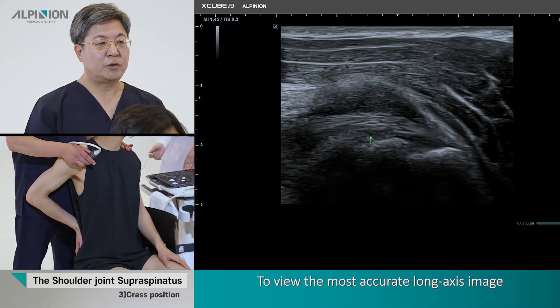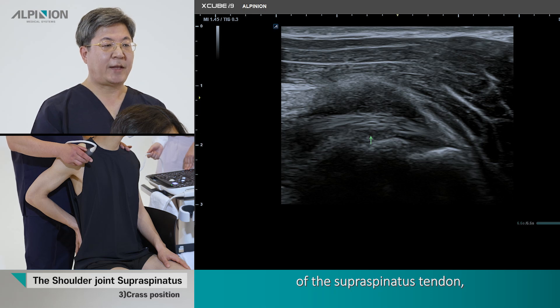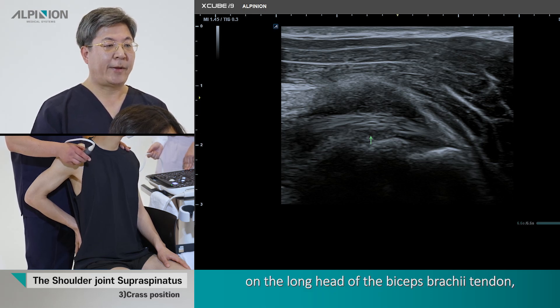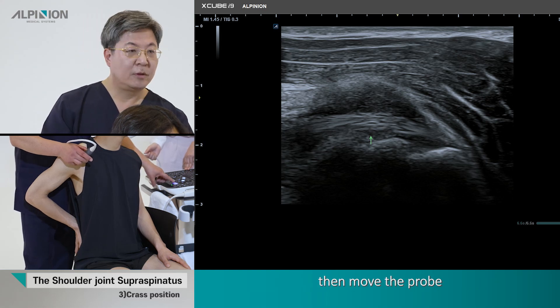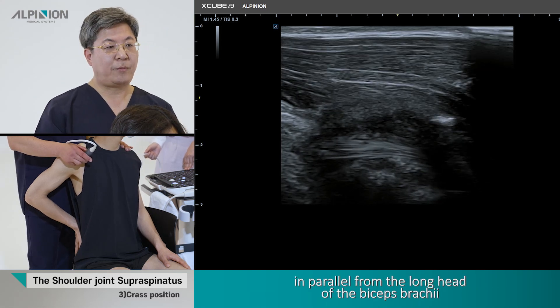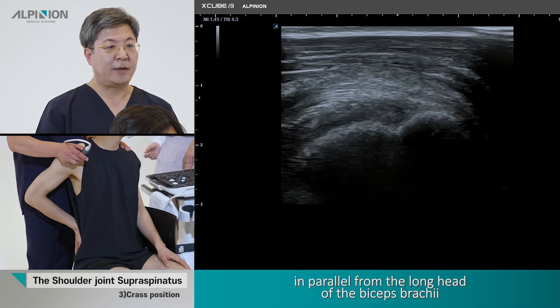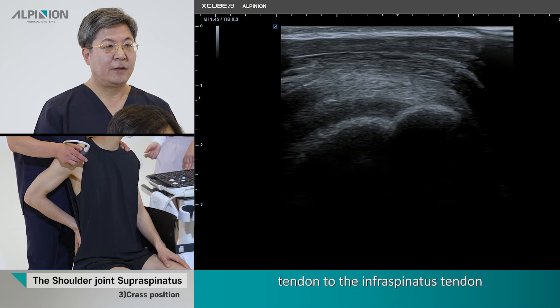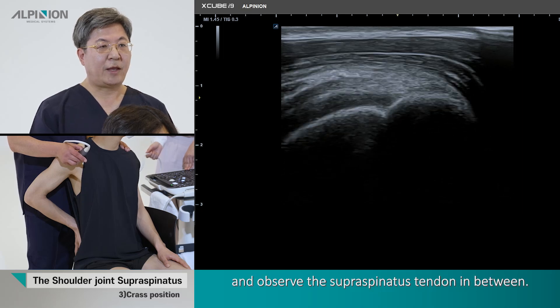To view the most accurate long axis image of the supraspinous tendon, place the probe along the long axis on the long head of the biceps brachii tendon. Then move the probe in parallel from the long axis of the biceps brachii tendon to the infraspinous tendon and observe the supraspinous tendon in between.